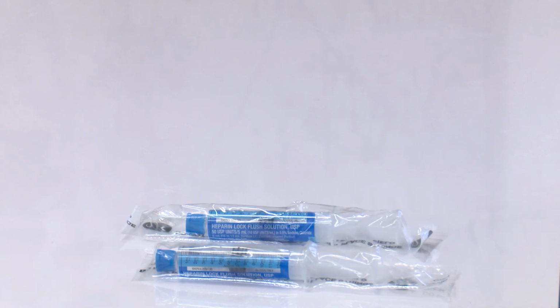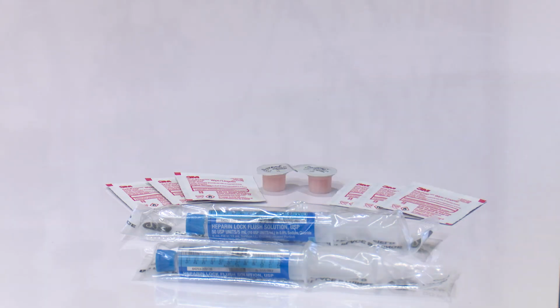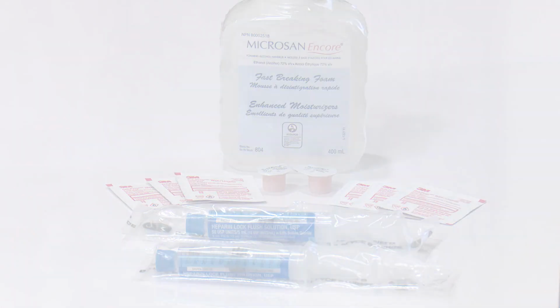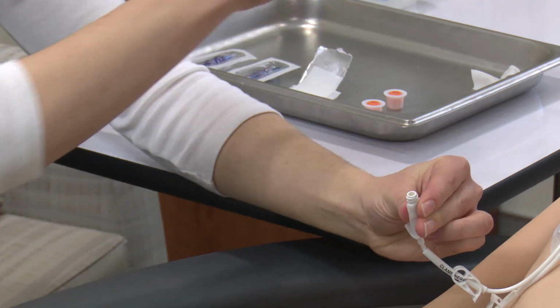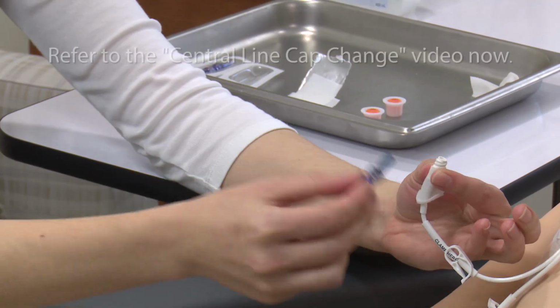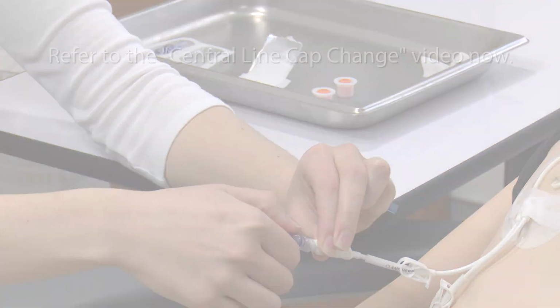Gather your supplies. To heparin lock your child's central line, you will need 1 heparin syringe for each lumen of your child's central line, 3 alcohol swabs per lumen, 1 swab cap, also known as a pumpkin, per lumen, and hand sanitizer. If you are planning to change the cap on your child's central line, this should be done before heparin locking. Refer to the Central Line Cap Change video now.